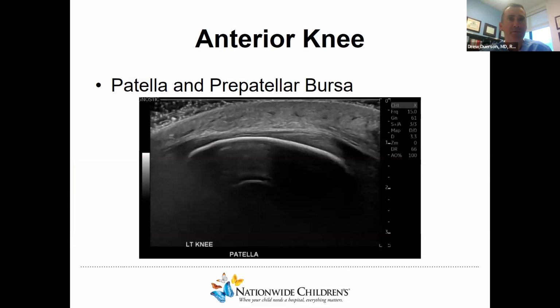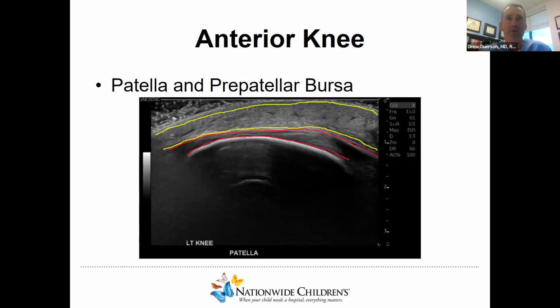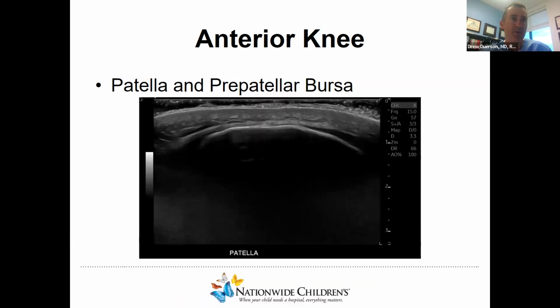So here's a long axis picture of our patient's patella. Shows no bursal fluid distension superficially. You can see that nice gel standoff, which is important. It can be a little bit challenging, but if you look close enough, I think you could see the superficial fibers of the quadriceps tendon is essentially in continuation with the periosteum of the patella. And then if you go more distally, the superficial fibers of that patellar tendon. So this really shows us that the patella truly is a sesamoid bone. And if we look superficially, we do see some soft tissue edema there in the yellow in those subcutaneous tissues, especially if you compare it to that contralateral normal side.